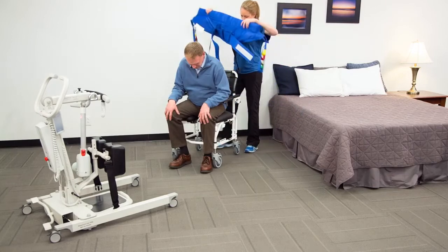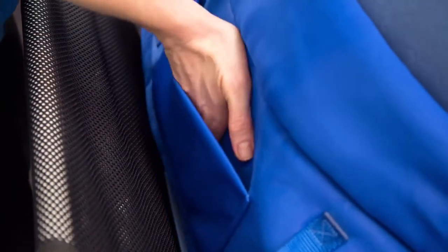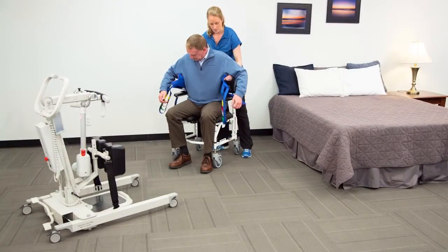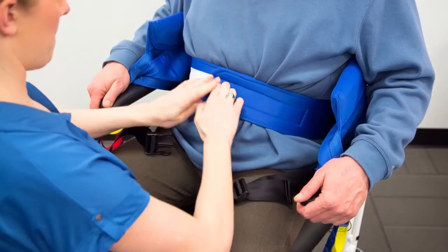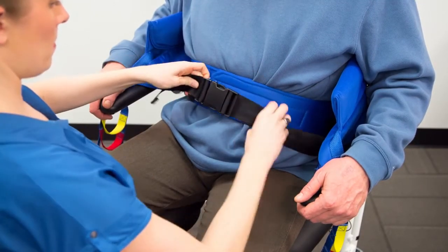Apply the stand aid sling from a seated position centered on the patient. Use the hand pouch if needed to position the sling. Wrap the body of the sling around the patient's torso with the patient's arms on the outside of the sling. Wrap the belt around the patient's torso and secure tightly with the velcro strips and buckle.